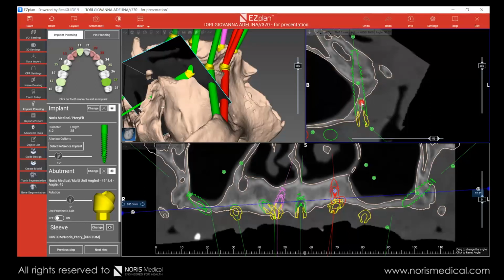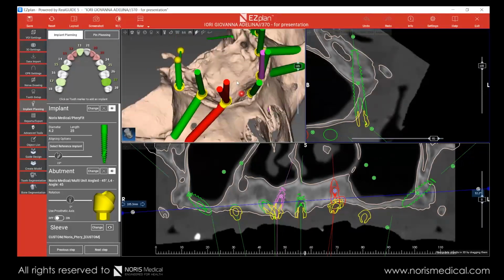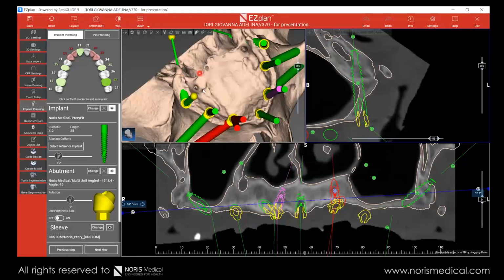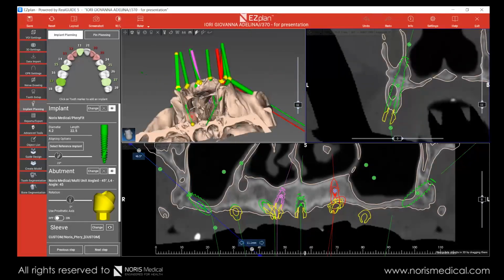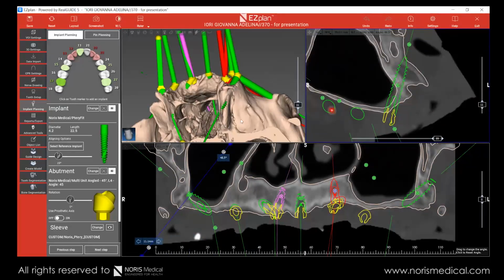a tuberosity. If we take, as I said before, the osteotome, we'll just fall inside, and this would be the direction here. And if you look from here, again, you'll see that the angle is going through the hamulus towards the medial plate. Okay, so this is a very important point to feel with the finger. Okay, let's look at the other side, again, going towards the medial plate, like that. And on the other side, going to the medial plate here.